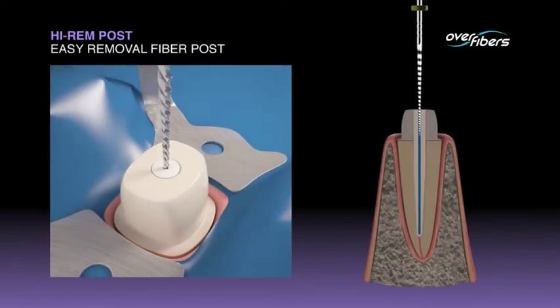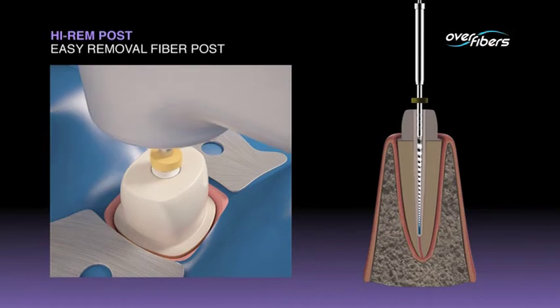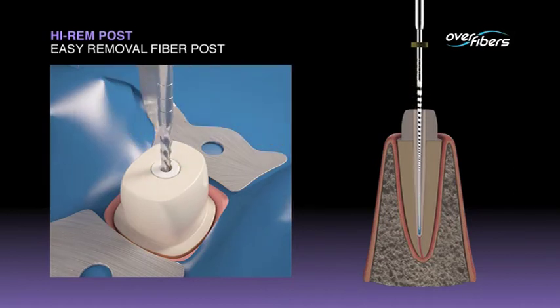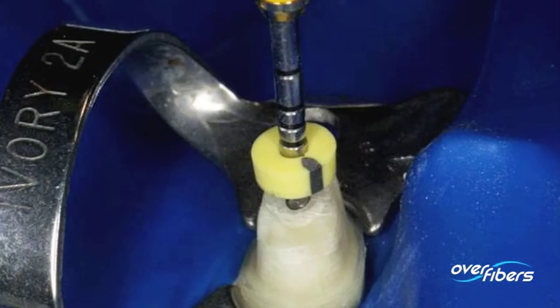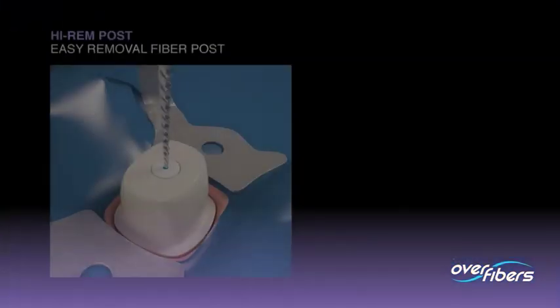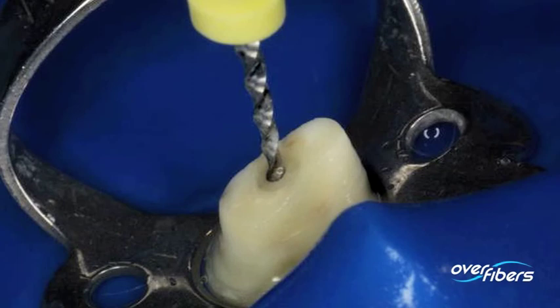At this point, using a medium high-speed fine nickel titanium drill of approximately 0.3 millimeters, you drill into the macrofiber. The procedure is repeated until the previously established depth is reached. Since the macrofiber is very soft, the instrument is guided towards the apical part by the hard walls of the post, without ever deviating from the central axis as occurs with normal posts. During the removal, the operator can clearly see that the instrument is penetrating the macrofiber, thereby assuring a sense of certainty that is rarely felt during the removal of a conventional post.